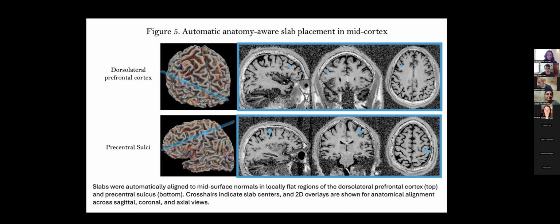But yeah, for sure. Maybe one last comment. Maybe you don't give yourself enough credit with respect to the intracortical arteries. I think in rodents they are much bigger, right? In humans they're smaller. So it's not only a matter of not having the resolution, but also we don't have the calibers in humans. That would also be a reason. It's not that the method is not good enough, it's just that the physiology is different. Yeah, definitely. Like in the primate, I think it took Jianbao some time to get to 70 micron, where he started seeing these arteries.